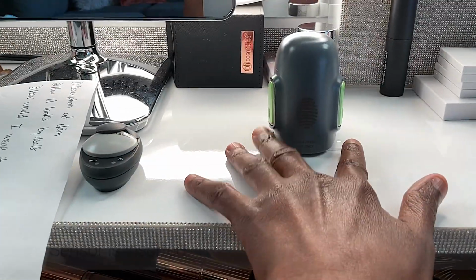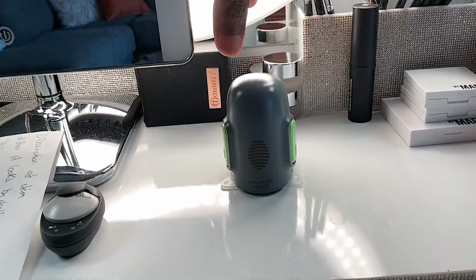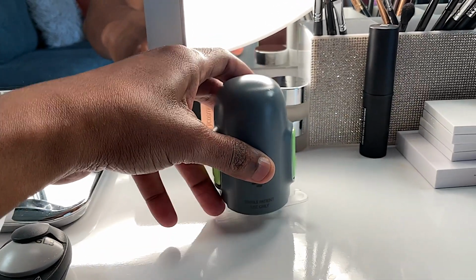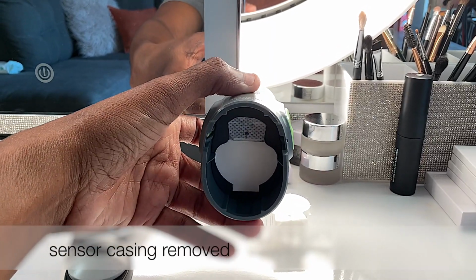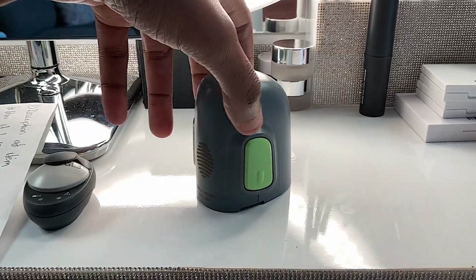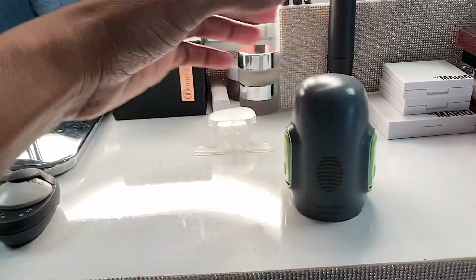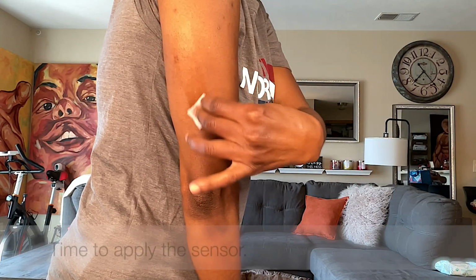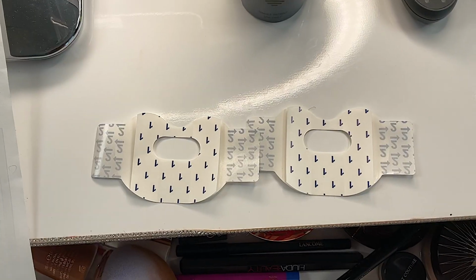So we're gonna use our fingers and hold this part and use this and pull up. So we have done it already. So I was able to pull it off. So this is how it looks. Gonna push on that. It's gonna release the sensor that was on this into my arm. But first, I'm gonna clean my upper arm with alcohol wipes.